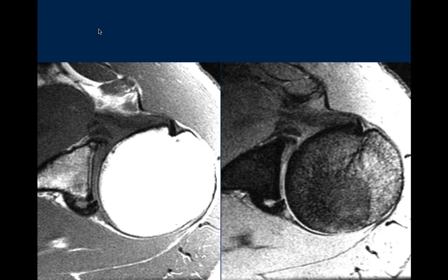Okay, thanks, John. Max, what do you think of this one? Okay, so we have an axial T1 and I believe that's a PD fat-sat on the right. We have thickening of the posterior glenoid. Blunting of the posterior glenoid plus some thickening, the dark signal. Anteriorly, we also have some. Are you talking about this? Yes. That's not the glenoid. Oh, that's just the capsule, giving us just a thickened capsule we're looking at?